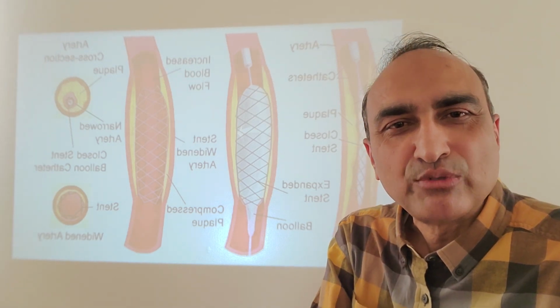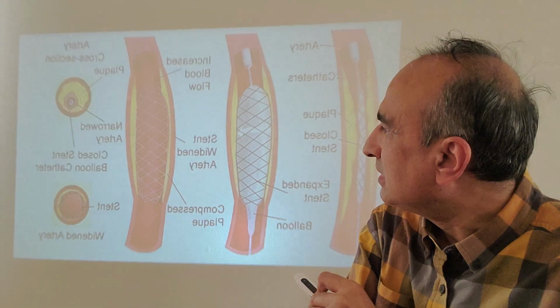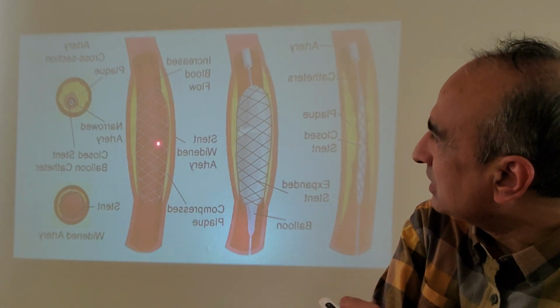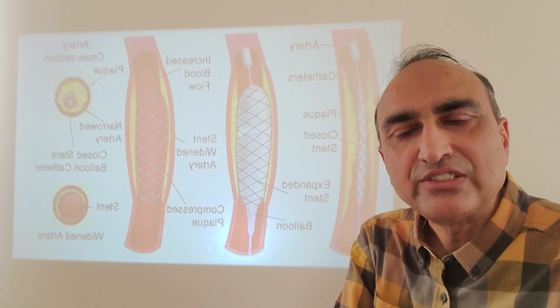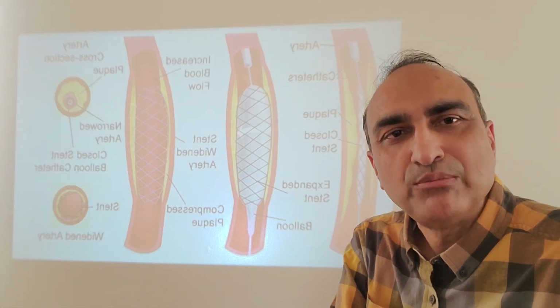But then later on, we found out that most of these stents actually ended up having problems, as the atheroma started to regrow inside the stents. One of the main reasons was diabetes. So diabetic patients have a major problem. As you know, coronary vessels are at the most 2.5 to 3 millimeter.